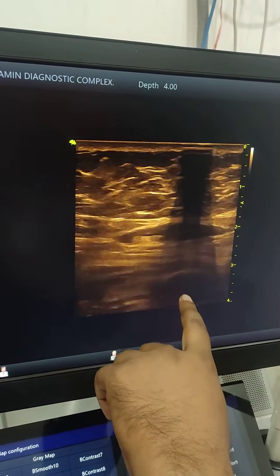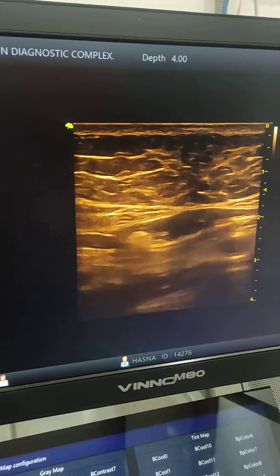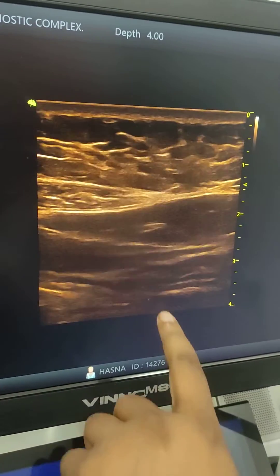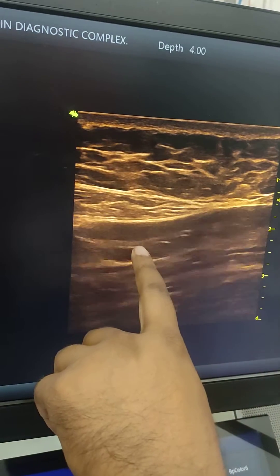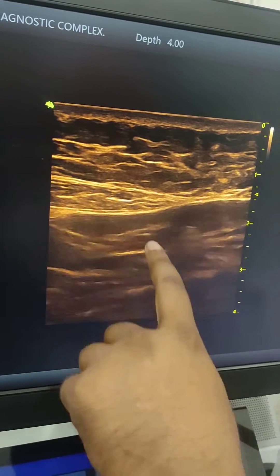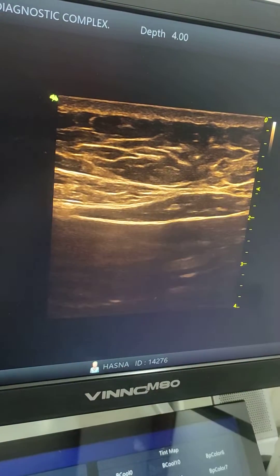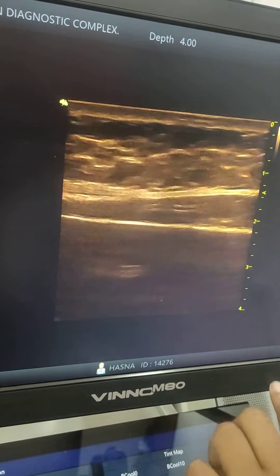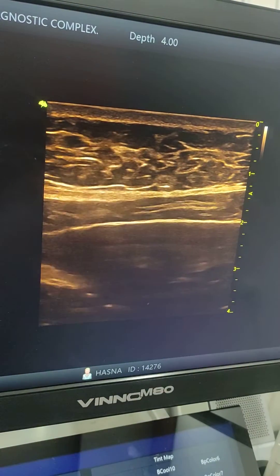This is the main pancreas and the patient has severe pain in this area, in the epigastric region. This is the main pancreatic duct.